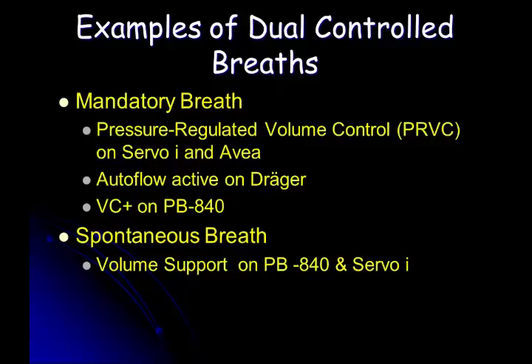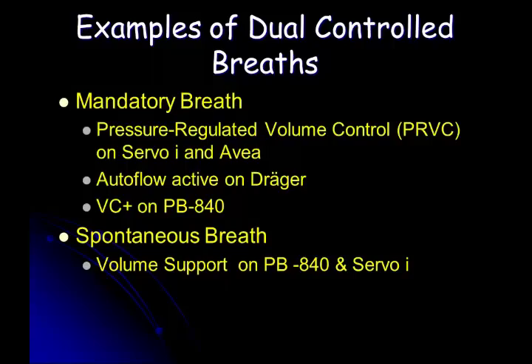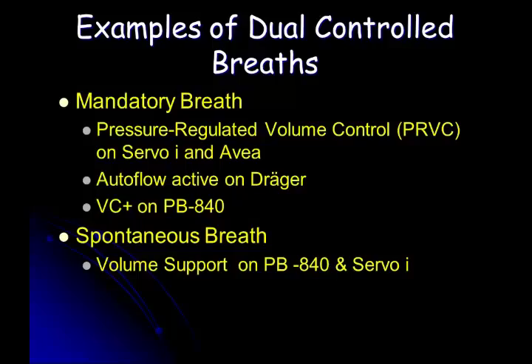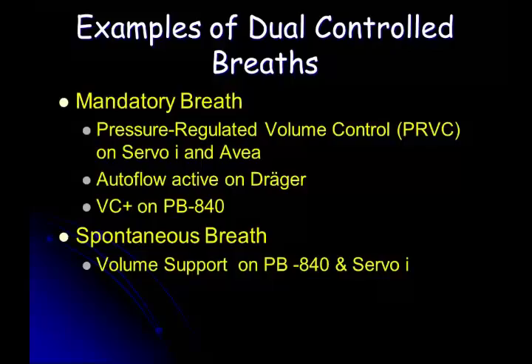I target a tidal volume. I say, you know what, I want to have that support, that boost. Give me a tidal volume of 5 to 8 milliliters per kilogram of ideal body weight. And so I tell it, target a tidal volume of 400. It will adjust the pressure support level up or down to get a desired tidal volume.